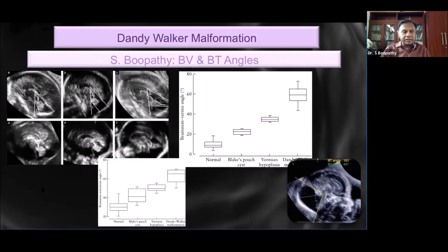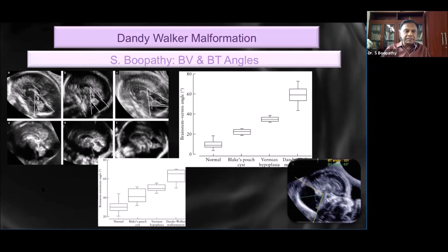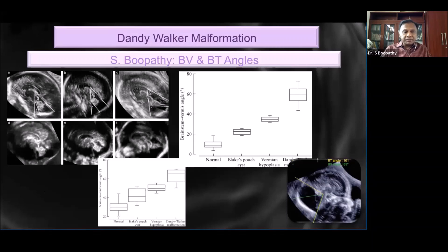Like in any other region, the brainstem vermis and brainstem tentorial angles came in. Both angles are measured in the mid-sagittal section of the posterior fossa. On the mid-sagittal scan, one line is drawn through the posterior surface of the brainstem, and the second line is drawn through the anterior plane of the vermis. The angle formed by these two lines is called the brainstem vermis angle.